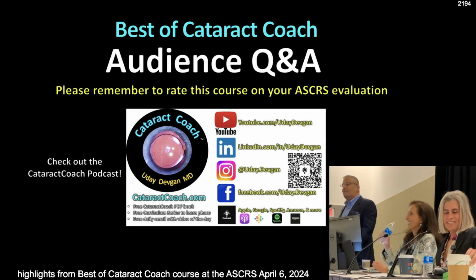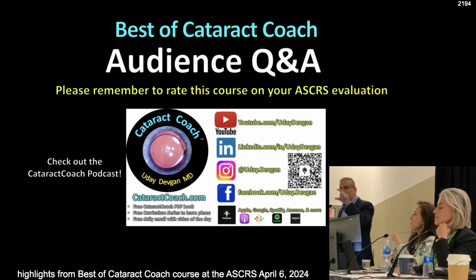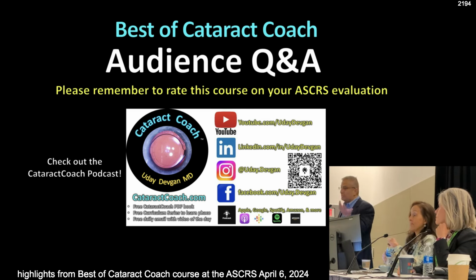Every day at the beginning of the day, I go there early and prepare it myself, and I show how to do it. I even show the part numbers of the exact filter I use. Again, if you go to CataractCoach.com, the website, not just YouTube, type in the keyword triamcinolone. It'll come up, and it's an easy step-by-step video of exactly what I do, and I show the part numbers of all the filters and all that stuff too.